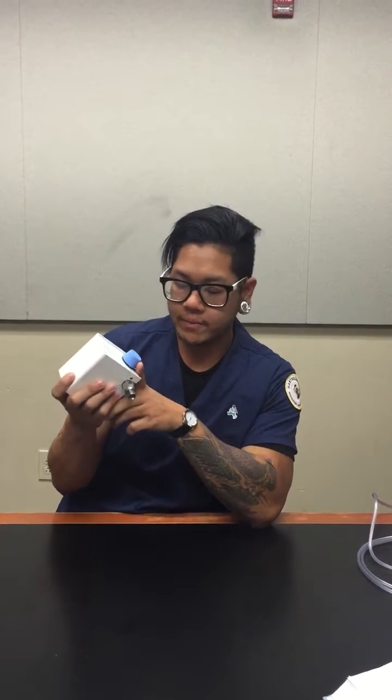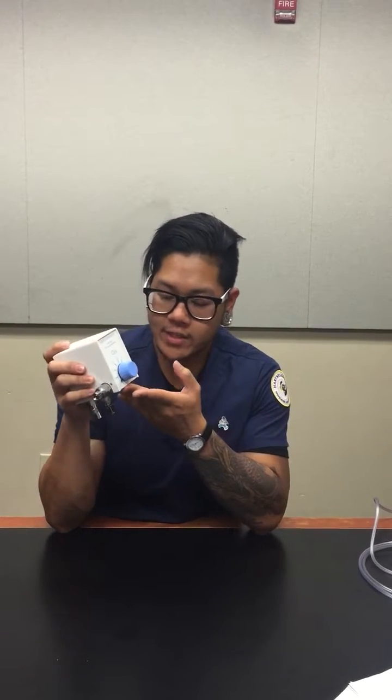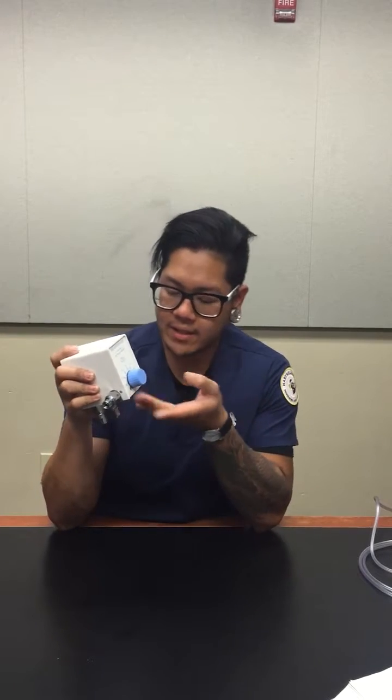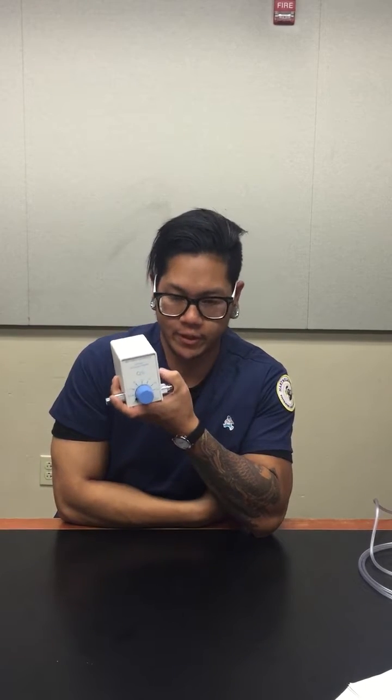And the advantage for it is that it gives a full range of FiO2, and the disadvantage is that you need 50 psi of air and oxygen to use this. And sometimes it's inaccurate, and you have blender failure. And best use is for patients with high minute ventilation and who need a high FiO2. And yeah, so like patients in neonate units and stuff like that.